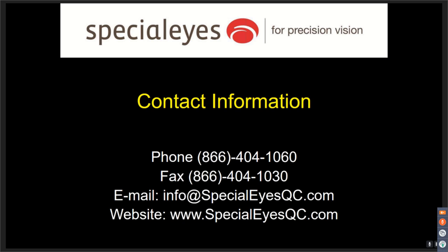Right. And Doug, how long do you usually let the lens settle before you assess the fit? If we remember to go back in, probably 15, 20 minutes, but sometimes they'll sit there an hour because we forgot about them. But they're still there. Oh, my God. Typically, now we'll put the lens on initially, or they'll put the lens on, if it's a toric lens.